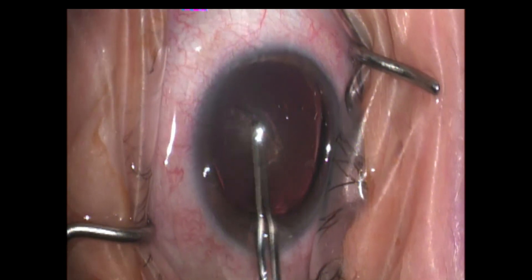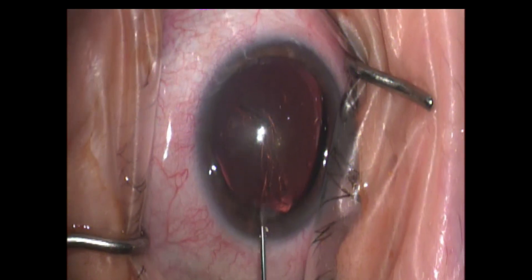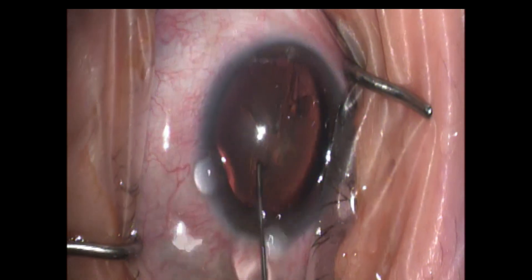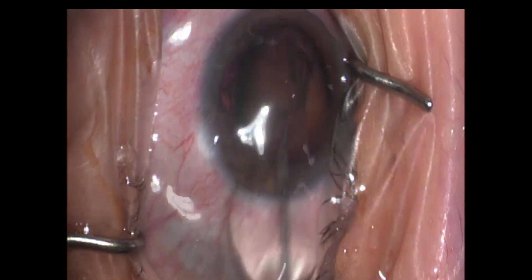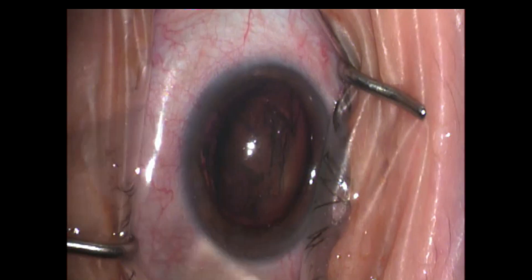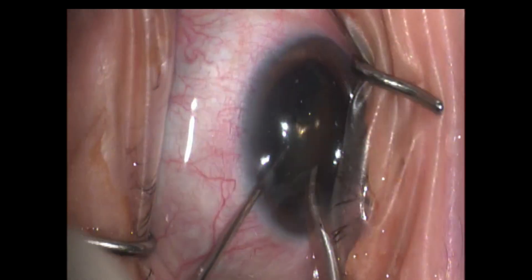Upon completion of the rhexis, we're then going to grab our cannula. In my younger patients, I like to kind of over-dissect here and burp the lens slightly into the anterior chamber. And right there you can see it pop right into the anterior chamber. I'm going to leave it just like that — I'm not going to push it back down in the capsule, because with these younger patients, that cataract is pretty gummy and soft and it can be very difficult to actually break it up into quadrants.